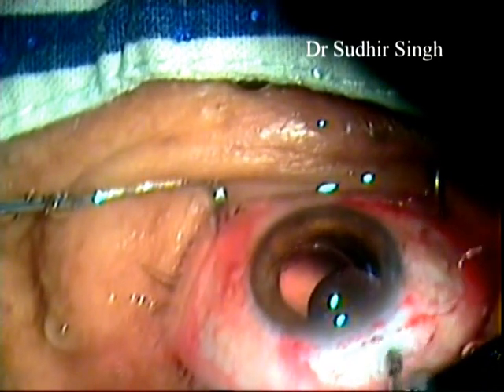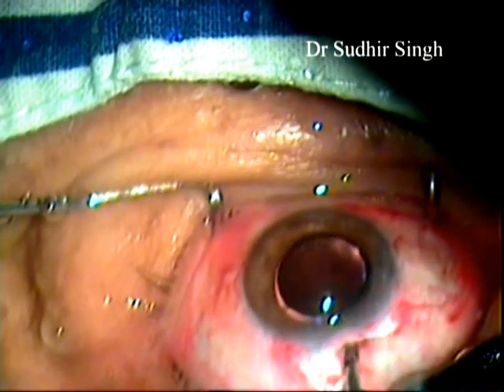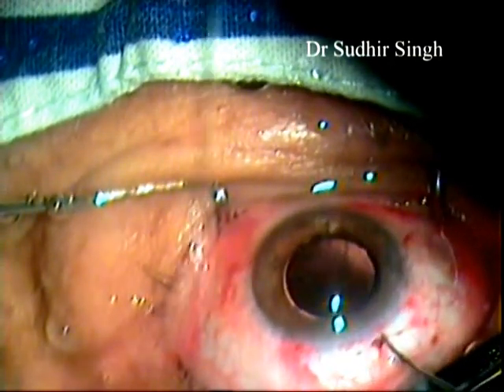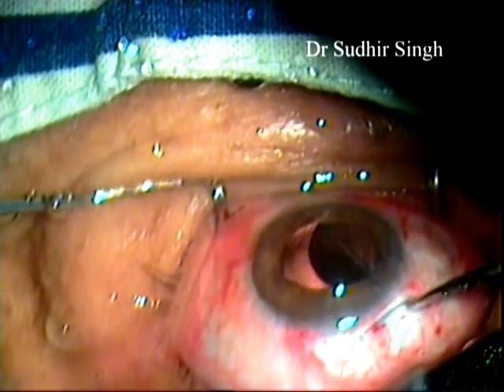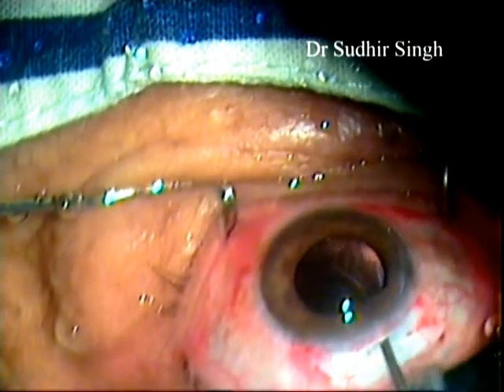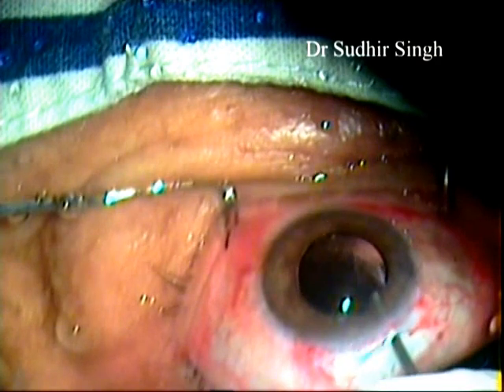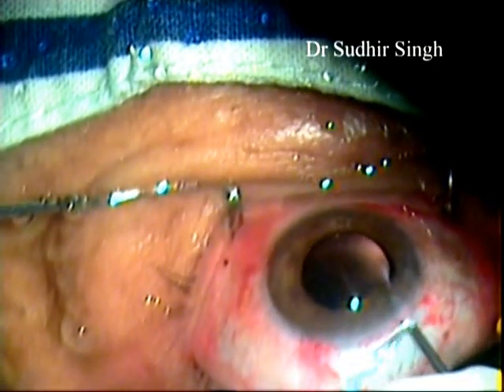The anterior chamber is formed with HPMC viscoelastic. A single piece PMMA intraocular lens is implanted into the capsular bag. Viscoelastic is flushed out by a 23-gauge Simcoe irrigation cannula mounted on a 10cc syringe filled with BSS from the main port.